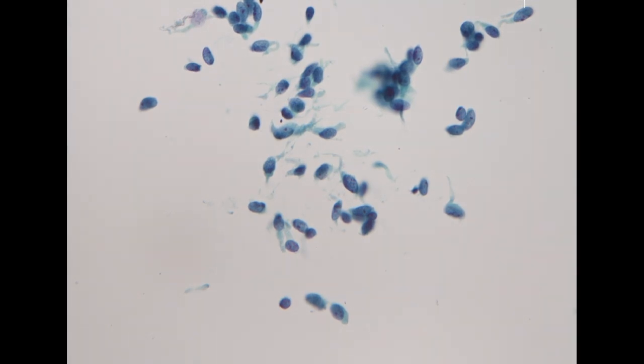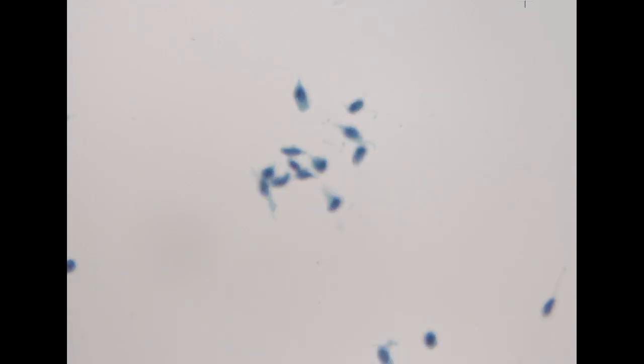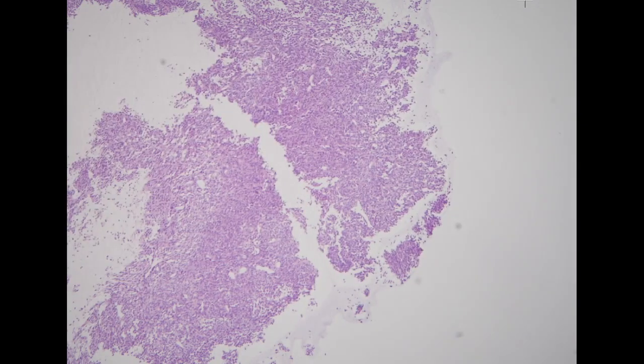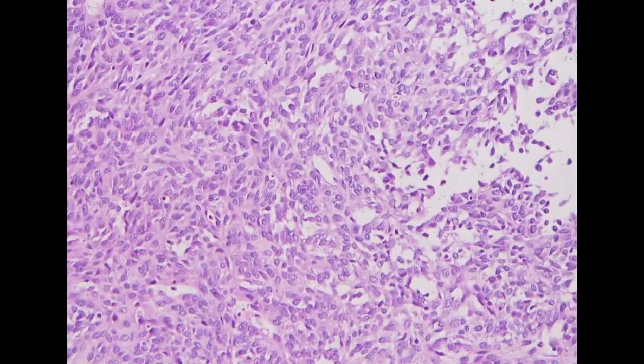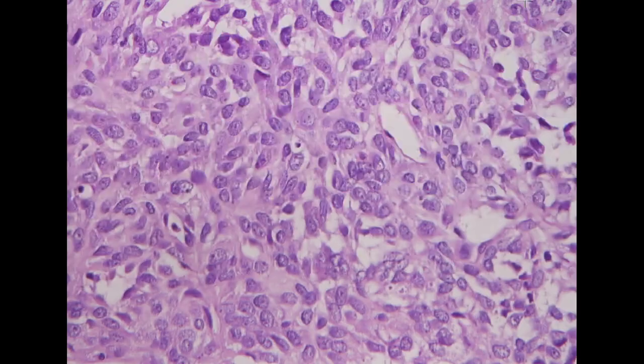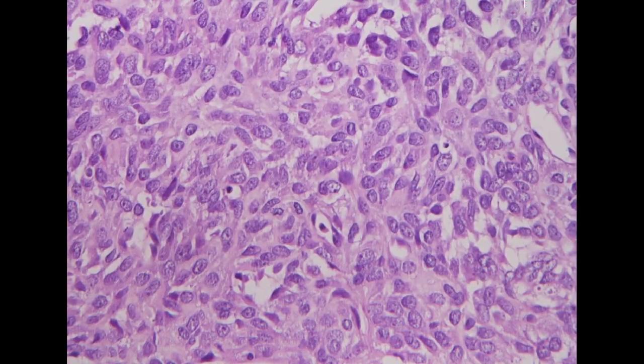So this looks like a translocation sarcoma. With this short spindle morphology, the most common sarcoma would be the synovial sarcoma. So we used the residual specimen from the liquid-based cytology to do a cell block. So indeed, we have a lot of tissue here. These show the similar cytomorphologic pattern that we see, the cells are very uniform with delicate chromatin pattern.